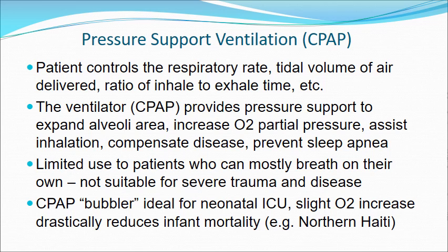Now, an exception is the CPAP bubbler, which is ideal for neonatal ICU, where a slight O2 increase with oxygen air mix can drastically reduce infant mortality. Justinian Hospital in northern Haiti was able to cut their infant mortality in half just by using CPAP bubblers, for instance.